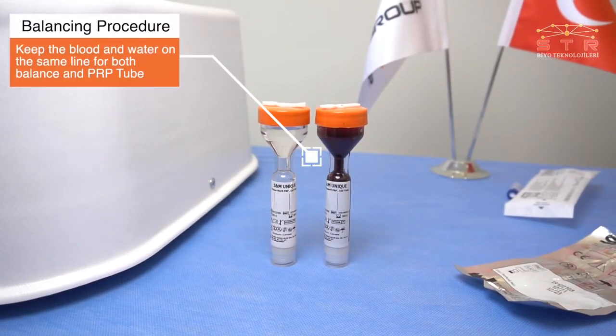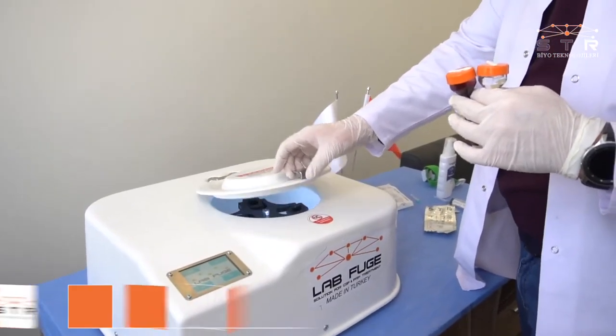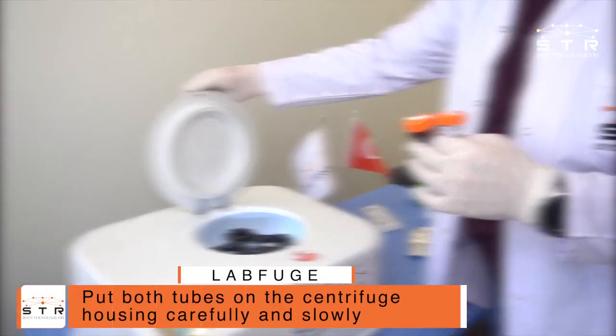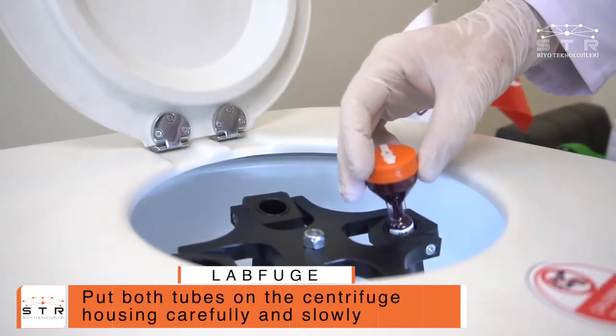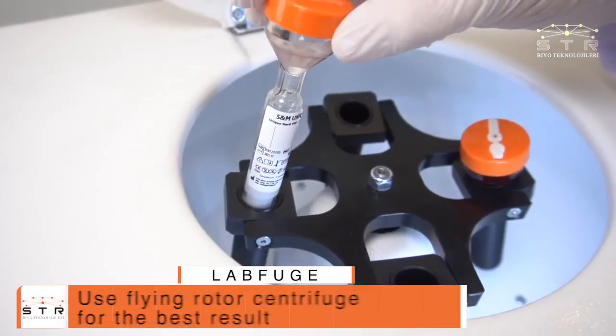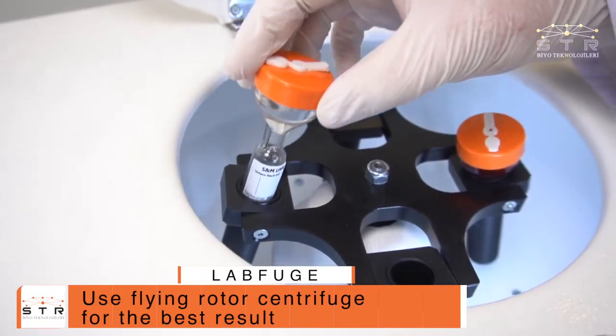Keep the blood and water on the same line for both the balance and PRP tube. Put both tubes on the centrifuge housing carefully and slowly. Use a flying rotor centrifuge for the best result.